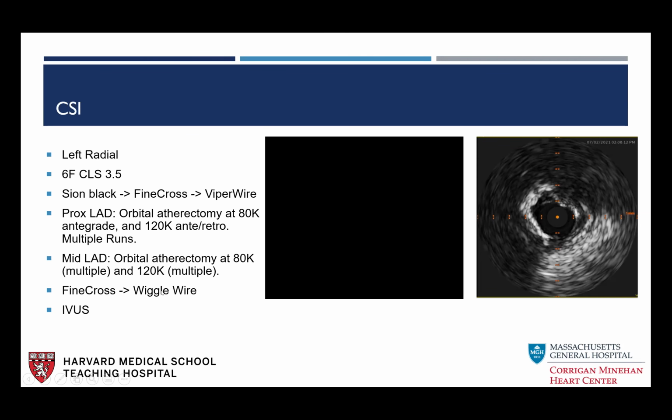We had some success with using cutting balloons and AngioSculpts recently with 270 and 360 degrees of calcium. It breaks and everything goes well, but it's of course very reasonable to use atherectomy here, especially orbital. Okay, I guess you do see it's actually more than 180 degrees of calcium, which is one factor.